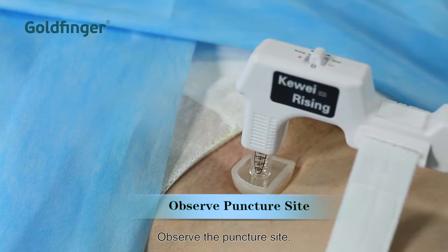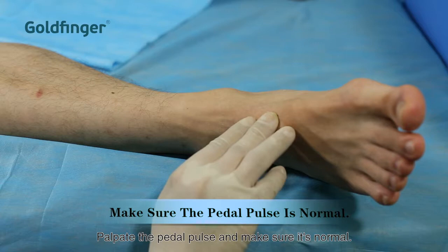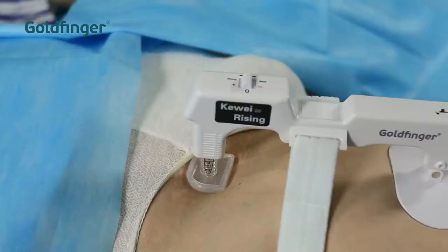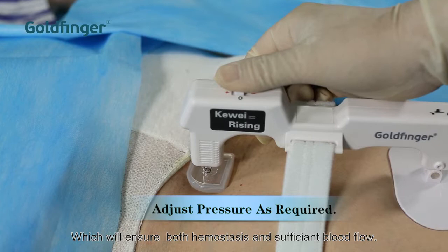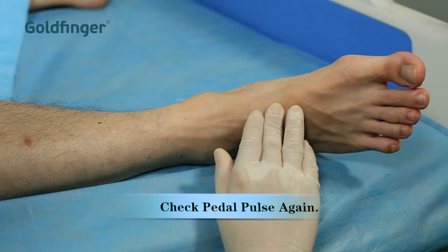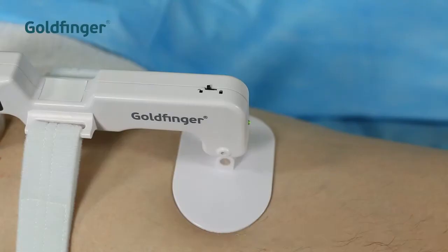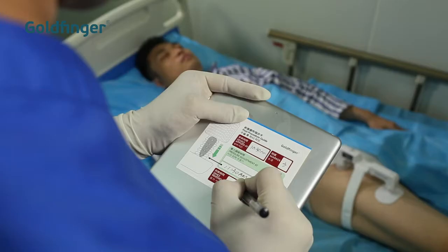Observe the puncture site. Ensure there is no internal or external bleeding. Palpate the pedal pulse and make sure it's normal. Adjust to the proper pressure, which will ensure both hemostasis and sufficient blood flow. Lock the safety at the right pressure.